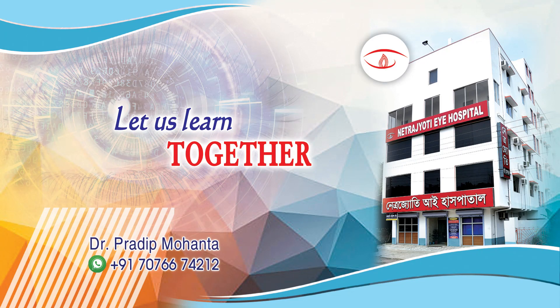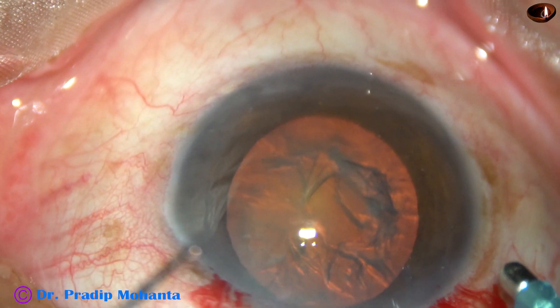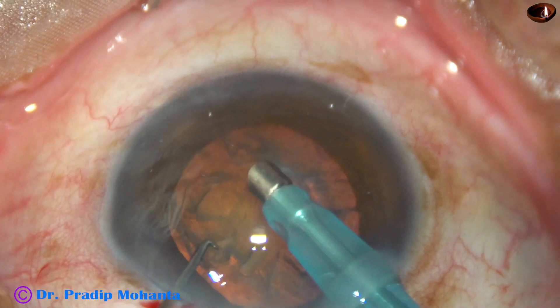Friends, welcome to my workplace at Ranaghat, West Bengal, India. Through this video, we are going to learn a technique of dividing a soft cataract of nuclear sclerosis, grade 2 or grade 2+.